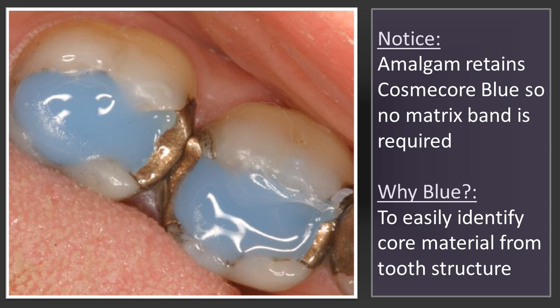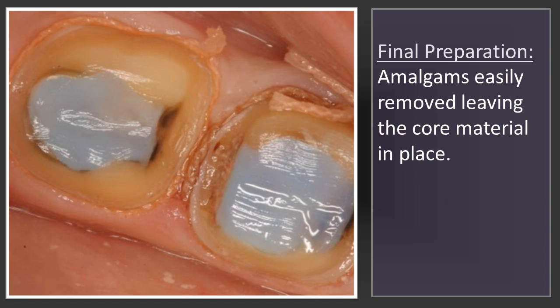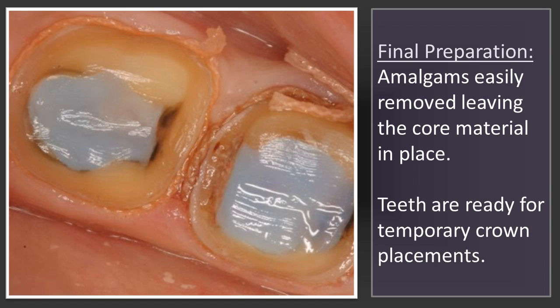What you can see here is the amalgams are still in place, but they're holding my core material so that I don't have to have a matrix band around the tooth. The tooth was prepped for a full crown and the amalgams would just come out, leaving the core material behind.